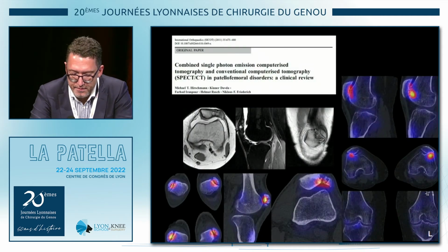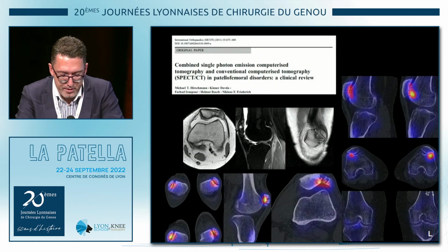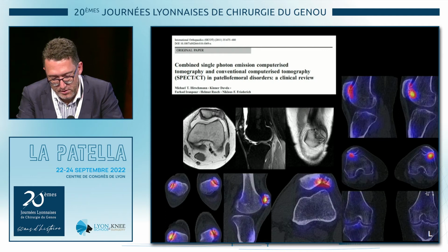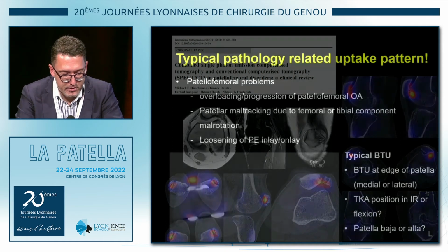So you can also gain information on native knees, as you see here. For example, this patella bipartite, which was formerly operated. This patient also got microfracturing of the patellar surface, and you see you get this information, and then you can understand better the biomechanics ongoing.